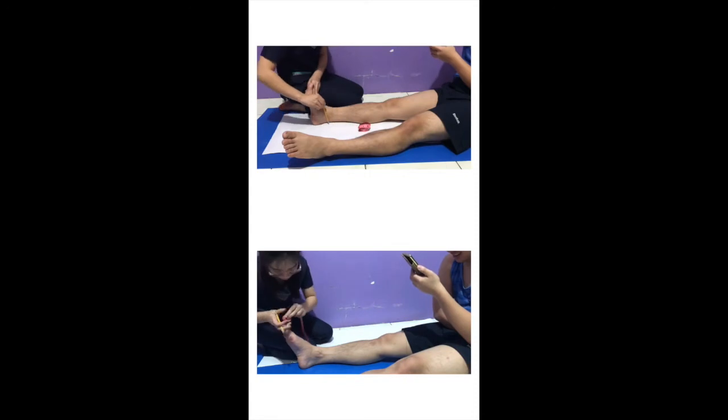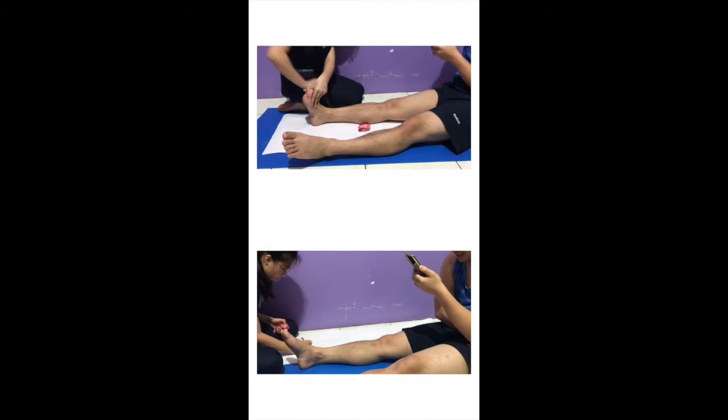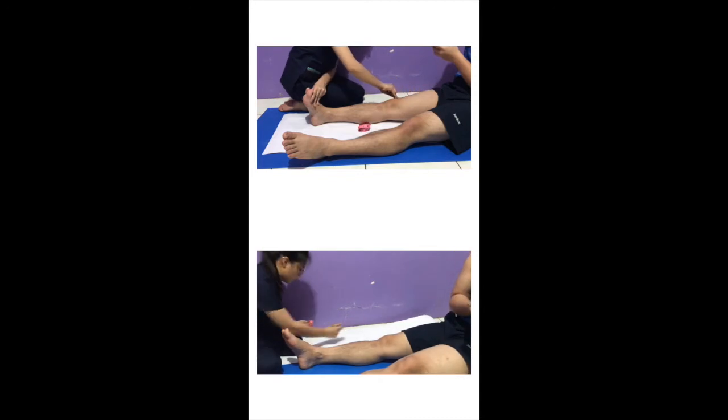Start tracing your patient's leg using a pencil from groin to heel and then thigh to heel. Then place horizontal markings on the groin, one finger below the groin, mid-thigh, knee joint, calf, and medial malleolus.